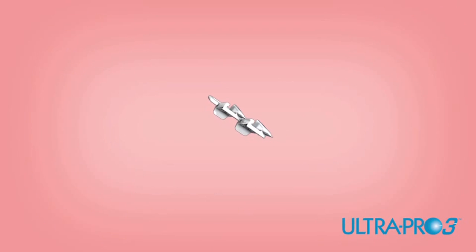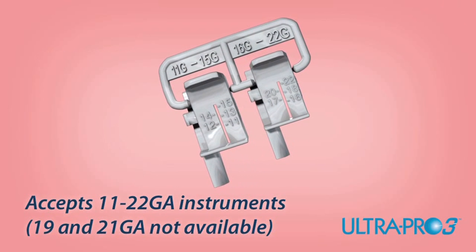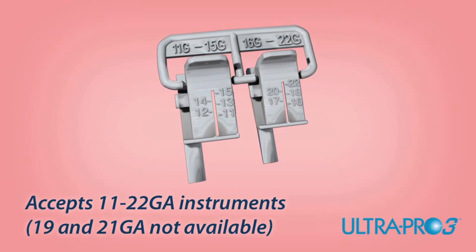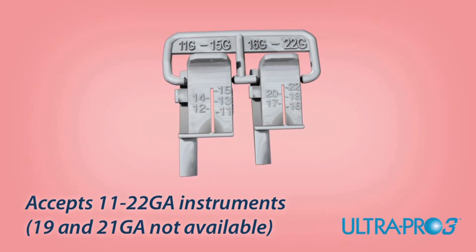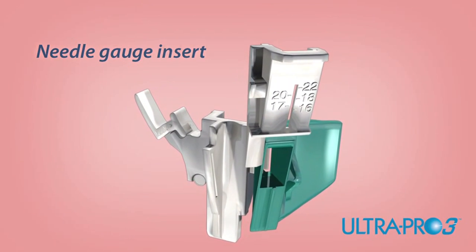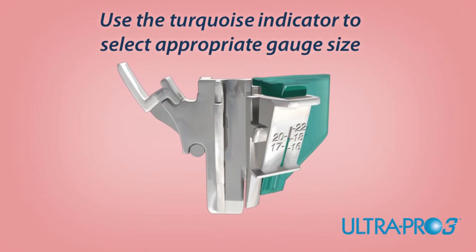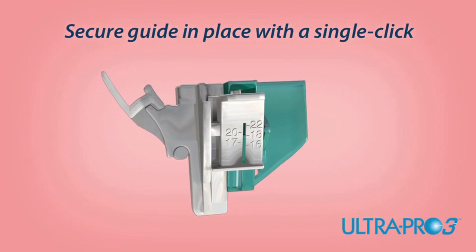The UltraPro 3 features a unique gauge selector, making it easy to identify and alter gauge sizes. The UltraPro 3 insert accepts a range of instrument sizes including 11 through 22 gauges. With the turquoise colored lever open, slide the selected needle gauge insert into the guide and align the appropriate gauge size with the turquoise indicator. To close, press the turquoise quick release lever which will click when closed.